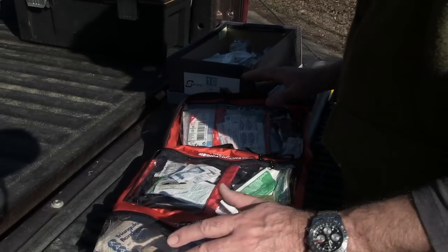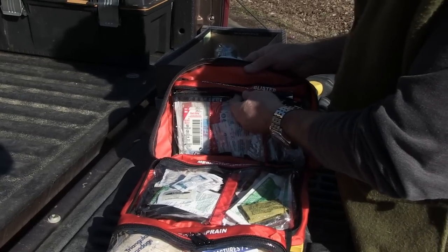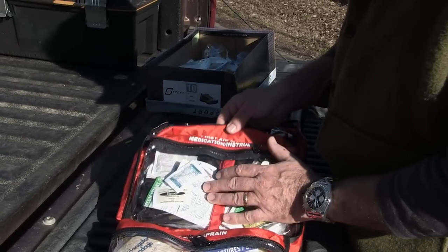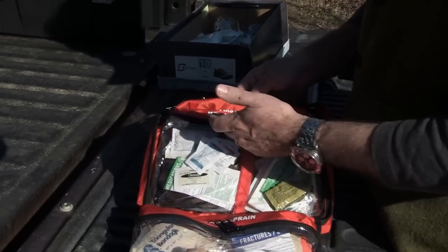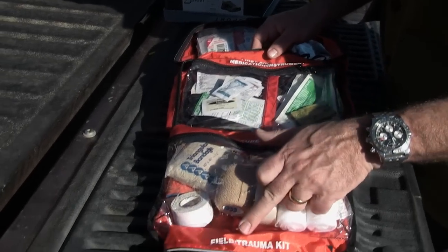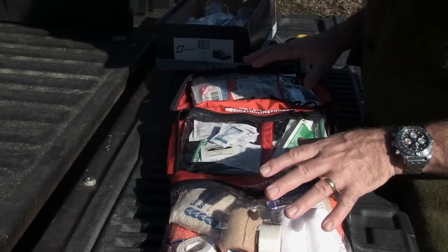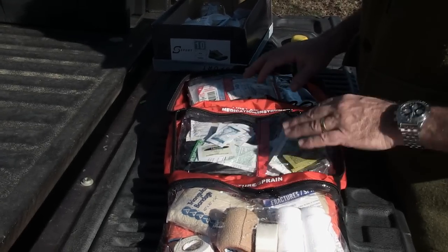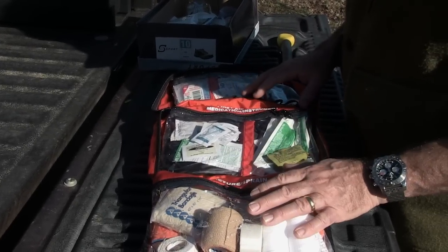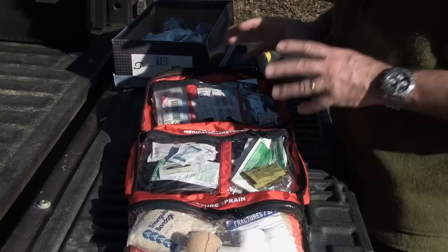Here we have a fairly basic kit that's divided into sections. Up here is the wound care, burn, and blister section. This is the first aid manual with medications and instruments. This is for fractures and sprains. And this is the field and trauma kit. These sections are not cast in stone — I've had to move things around a little bit just to make them fit.